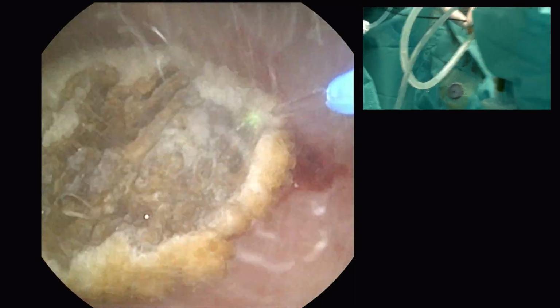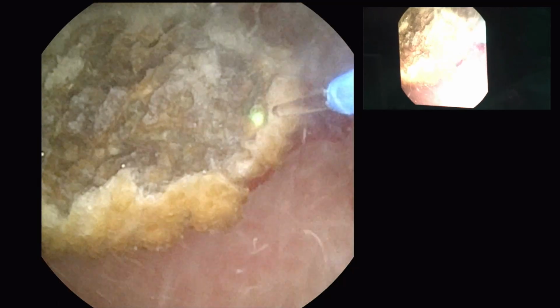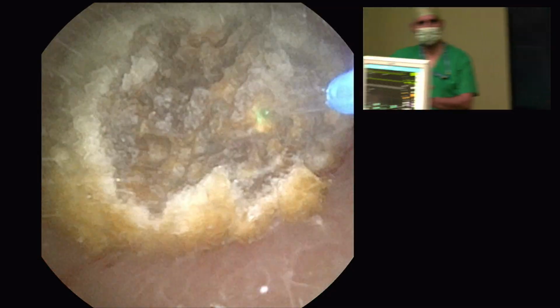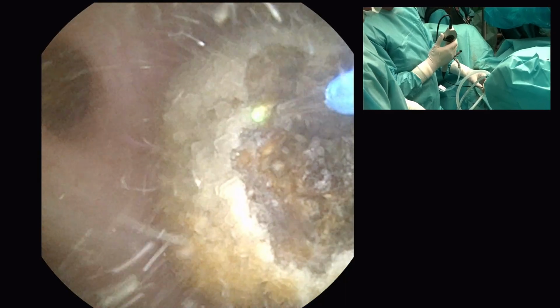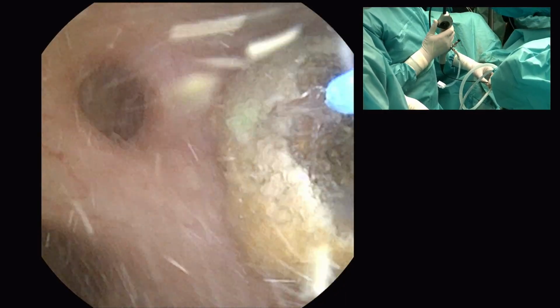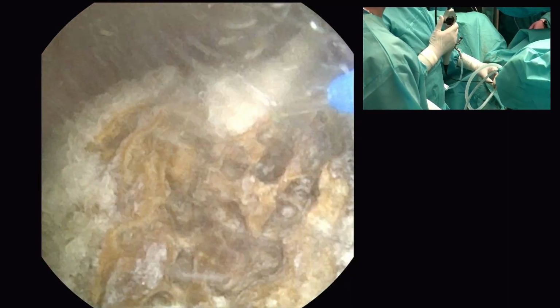Good morning, sir. This is Dr. Imran. Sir, is the patient under general anesthesia or spinal anesthesia? Under GA. Okay. His question is, can it be done under spinal anesthesia? Because you see, the movements. Can we have the anesthetist and ask him if he could do it under spinal anesthesia?